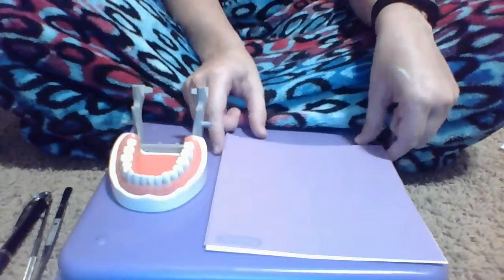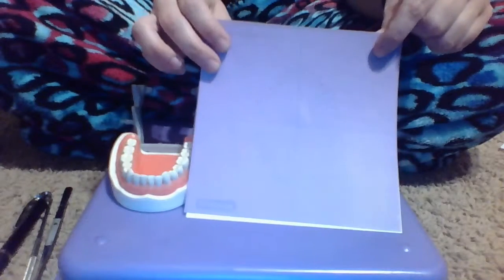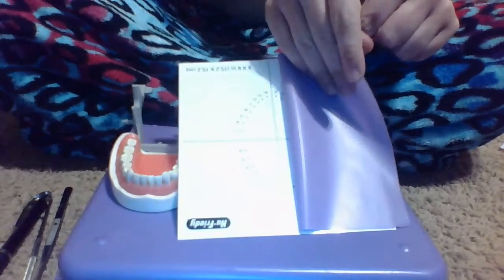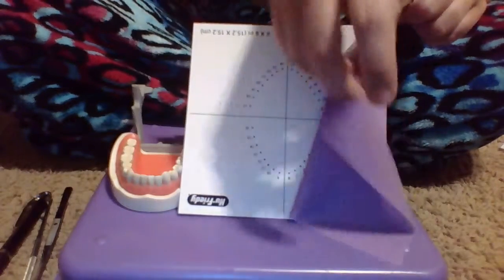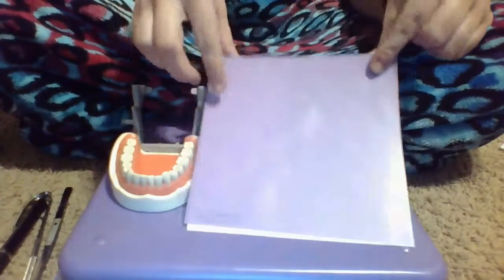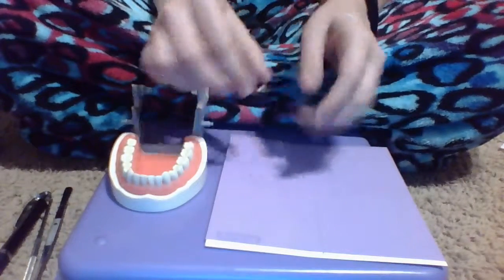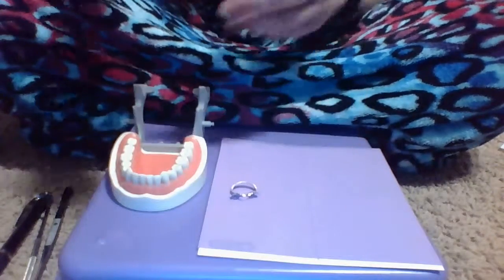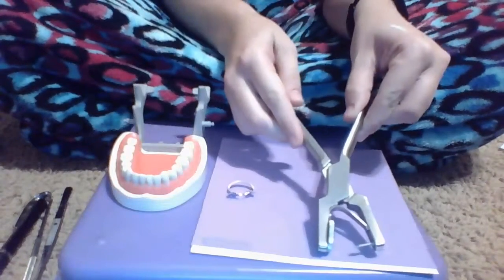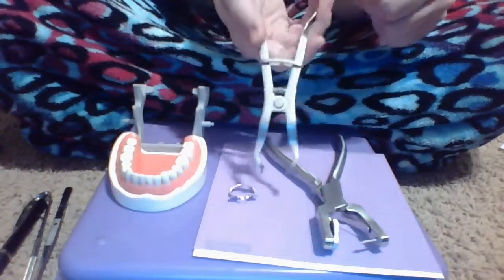I'm going to gather my materials first. I have my dental dam material and my chart to show where to put my holes in my dental dam. I have my clamp that you put on the tooth, my dental dam hole punch, and my forceps.